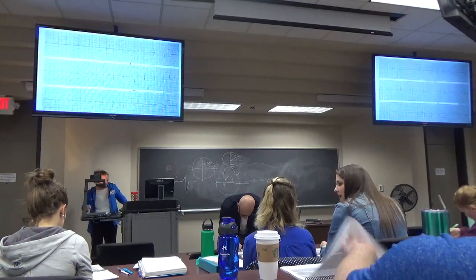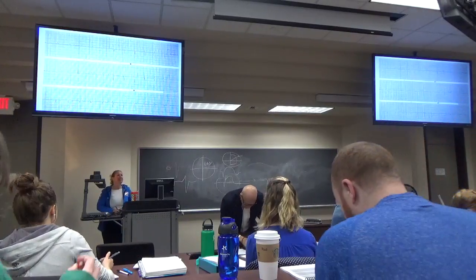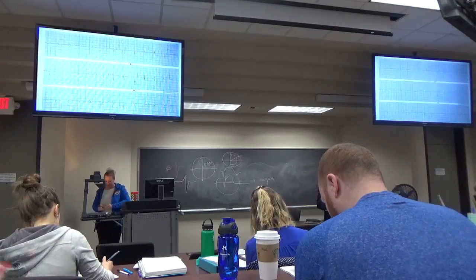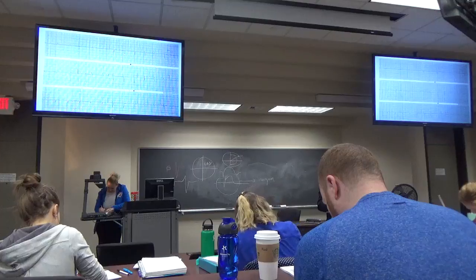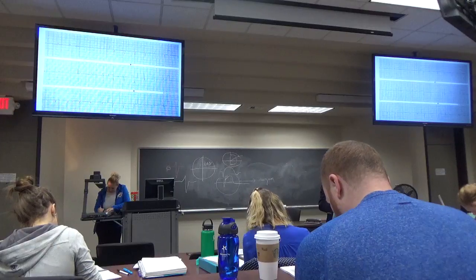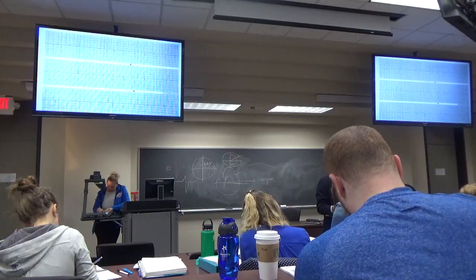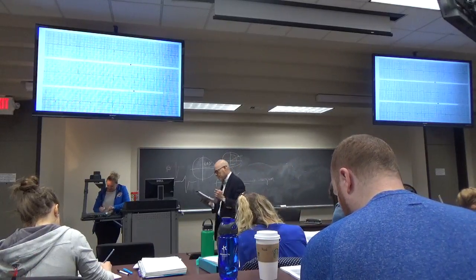Michelle. 27? Yes, because 26 is missing. That's correct. So I got normal sinus rhythm with a rate of 65, PR interval of 0.18, QRS of 0.08, QT of 0.4, and then the axis I got LAD at negative 65 degrees, and then I got acute inferior MI.